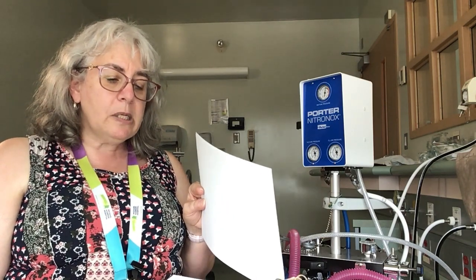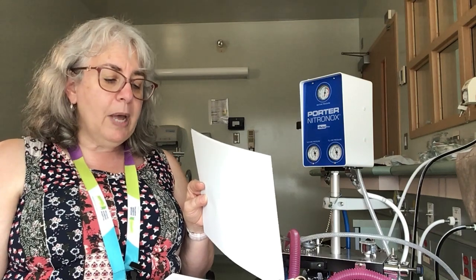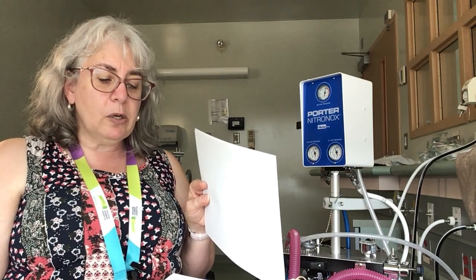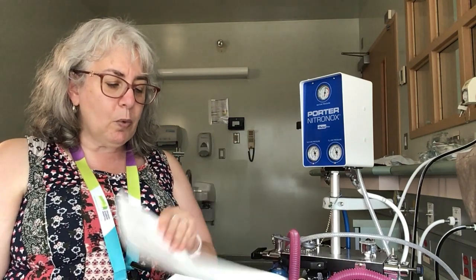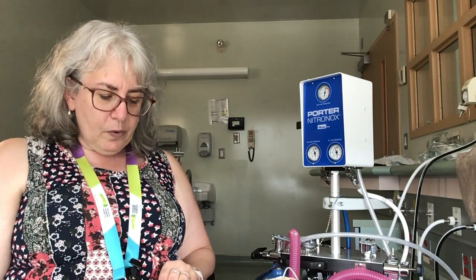If the patient is not improving or becomes pulseless, we're calling a code blue, a protected code blue, and being prepared to call an OBS alert and possible code pink as required. That is probably the worst case scenario. So I talked a little bit about common side effects being feelings of euphoria.